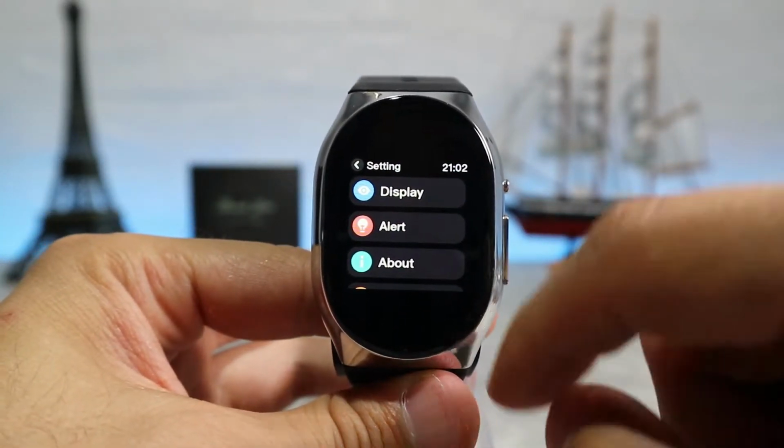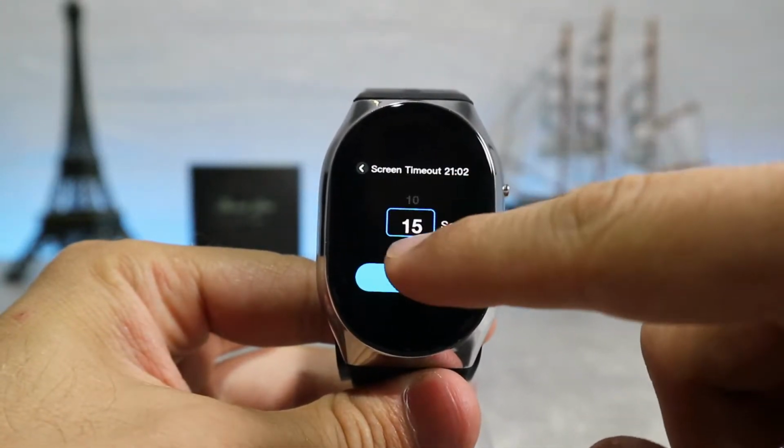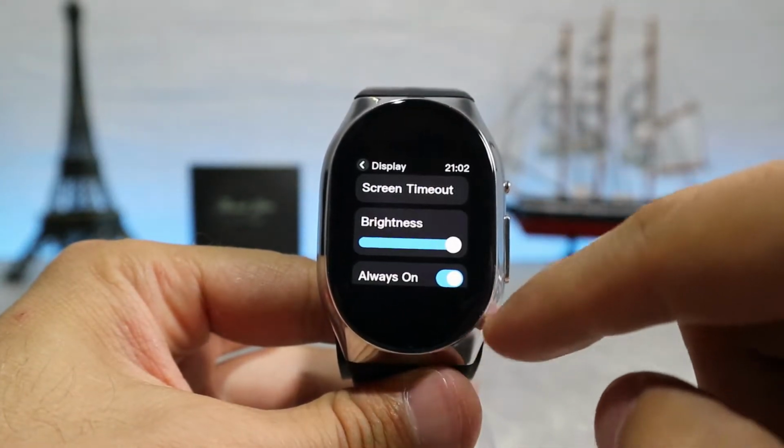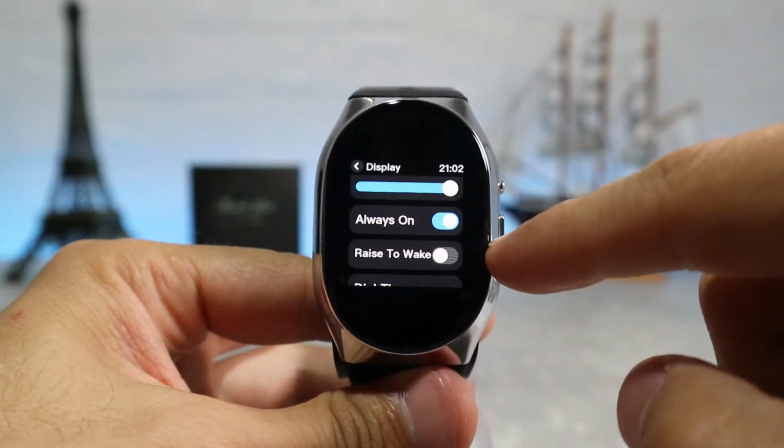Next, we have the settings part, which provides some options with the display. You can set the screen timeout from 5 to 20 seconds, adjust the brightness, set the screen to always be on, enable raise to wake, and change the dial theme.